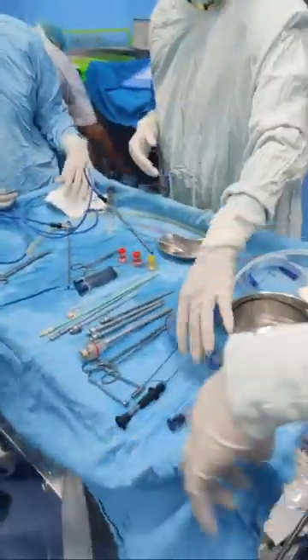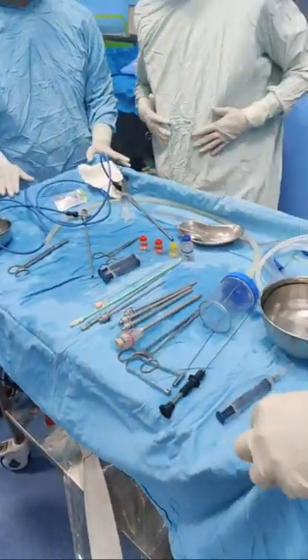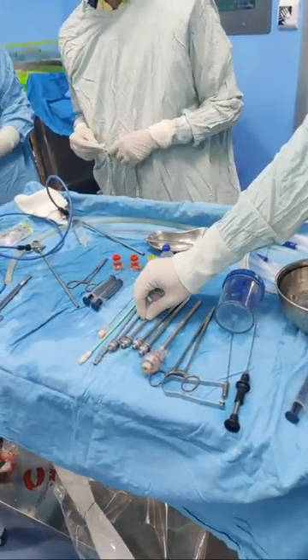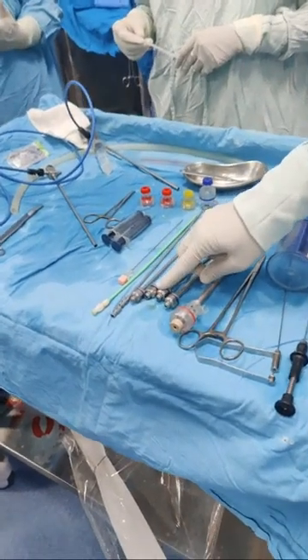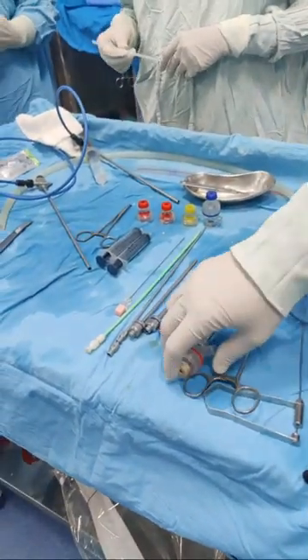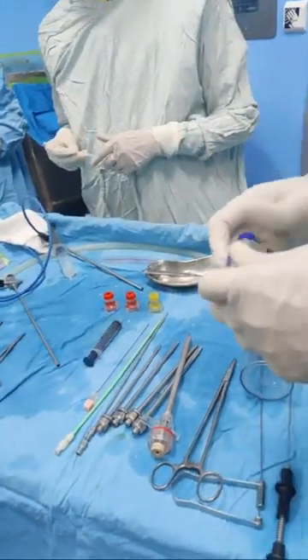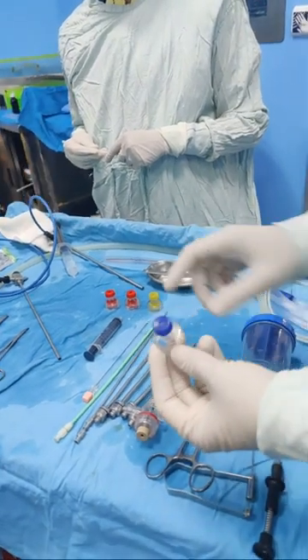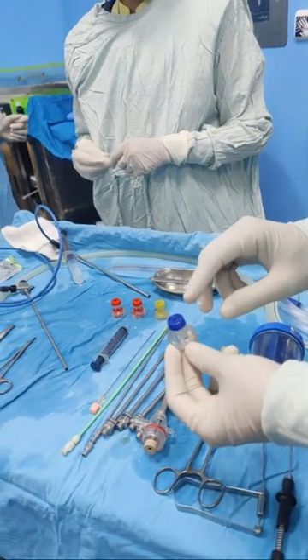Show the instruments. I'll first talk about the sheath. There are different sizes: 12 French, 15, 18, 21 and 24. This is the sheath with a dilator. The second part is a suction master. And the fourth part is a connector. There are different sizes of connector that fit with the different sizes of nephroscope.